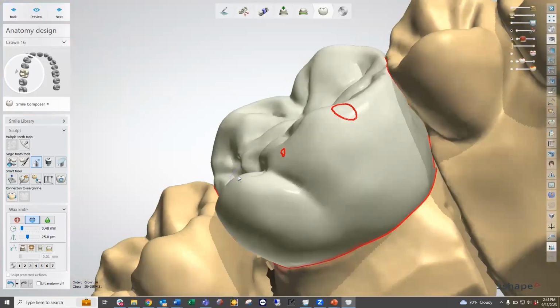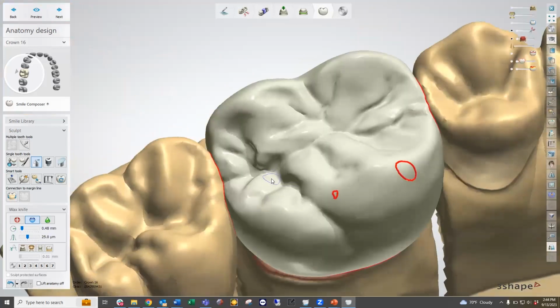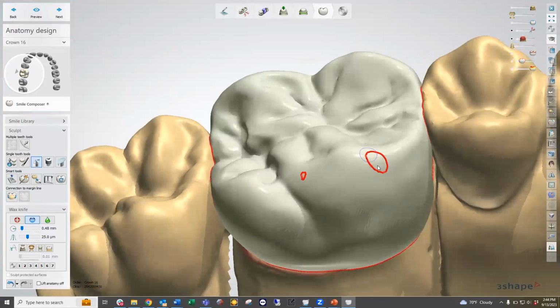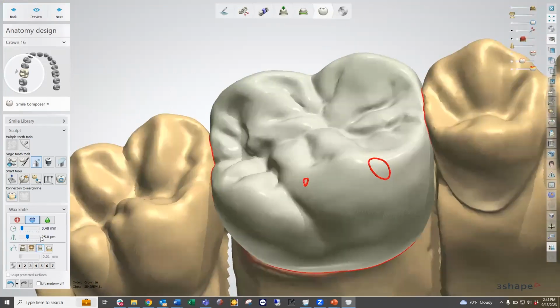So after we've added our occlusal anatomy, we can make subtle changes or finite changes to these instances that we see, like we're hitting up here. And we can either do that with the subtracting tool, or we can do that with settings that we have under our smart tools, which are contacts and smoothing.